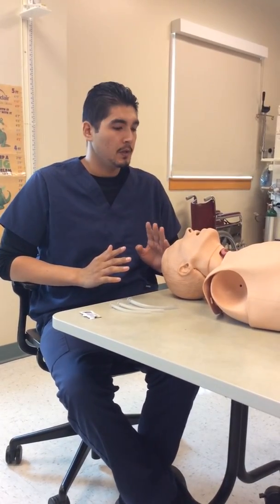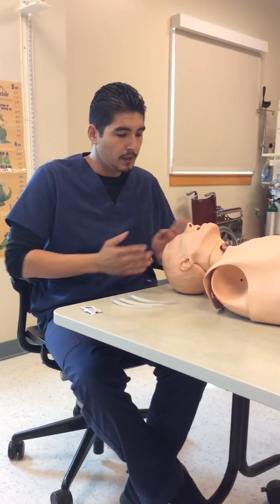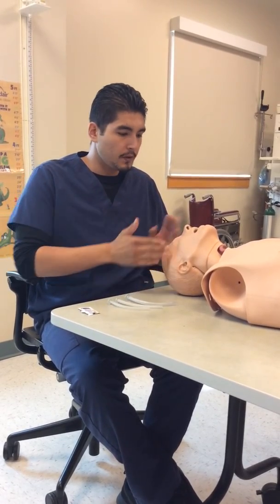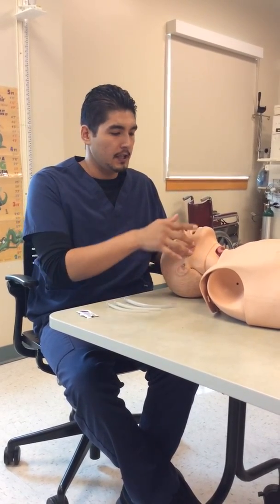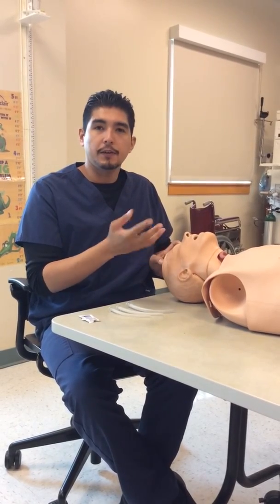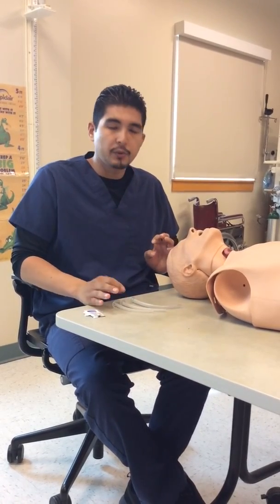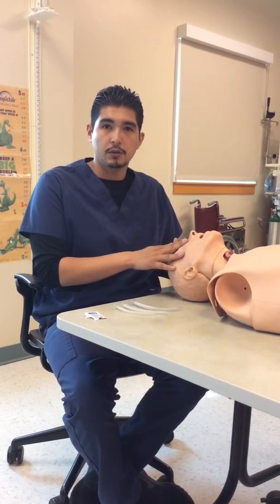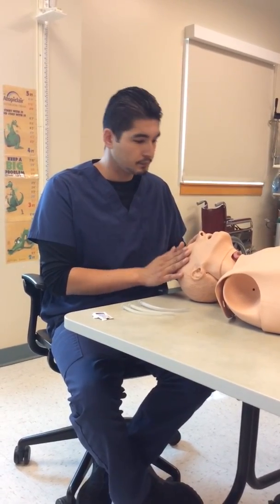So first thing you want to do is verify the physician's orders. So why was an NPA ordered? NPAs are used in semi-conscious patients that have a need to establish an airway, but can have some sort of trauma to the airway, so you can use a nose. As well, if a patient needs constant suctioning, an NPA can be put in place. The only real contraindications to NPAs would be if the patient has damage to the nose or they're bleeding heavily, then you would not want to use an NPA.